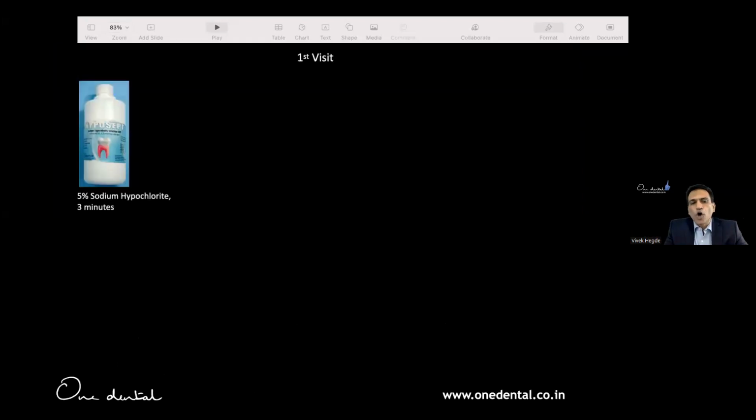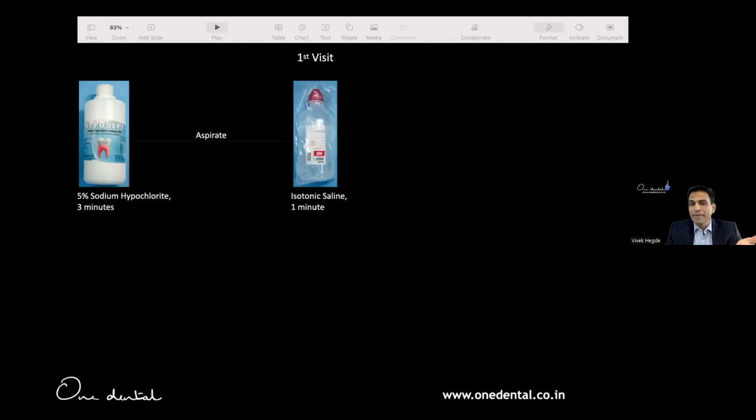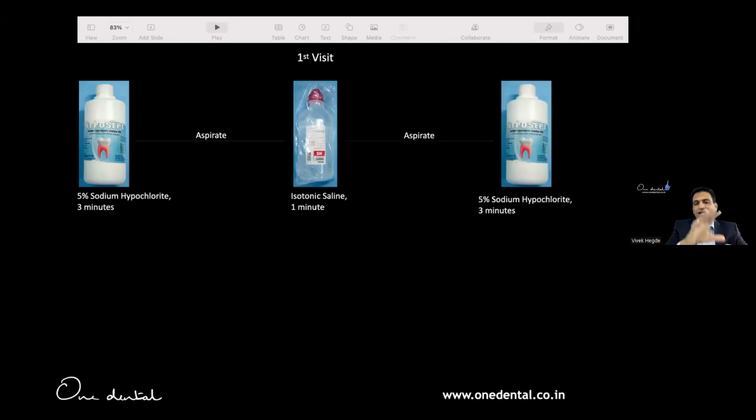So quickly, we'll go with the protocol. After my master shapes, I do this. I use 5% hypochlorite, 3 minutes. Aspirate it out. I may take half a minute for that. Wash it with saline. You know why? Because dried cells, tissue tags, they block the system. Again, aspirate it. Again, put hypochlorite 5%. Now, by doing this much, you know what? 3 minutes, half a minute, 1 minute, half a minute, 3 minutes. So I've already spent about 8 minutes here.